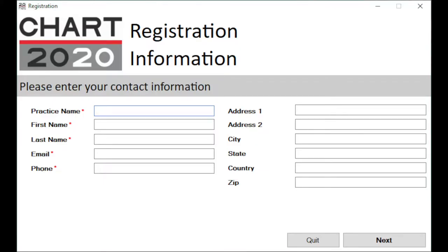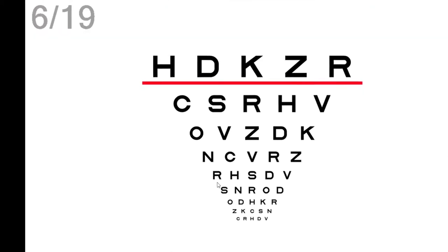Enter your registration information. This information you capture here will be displayed on all the reports.